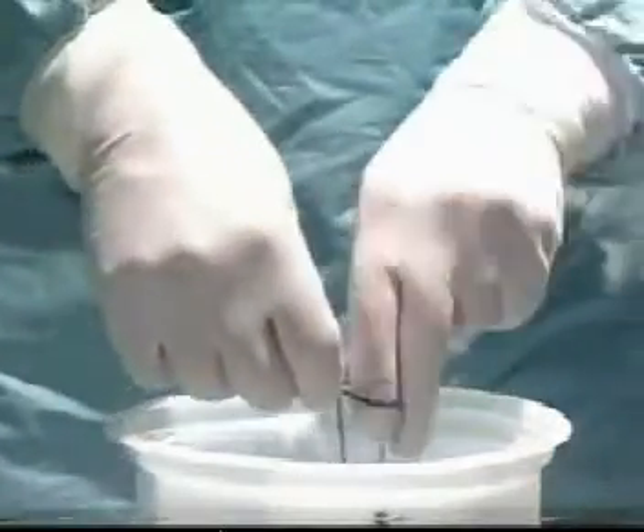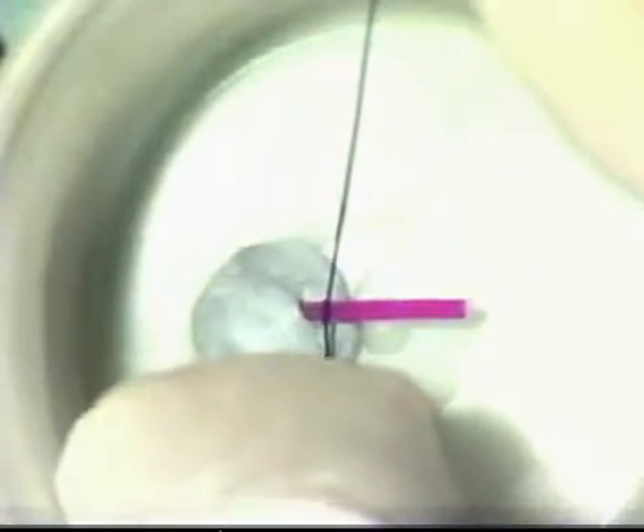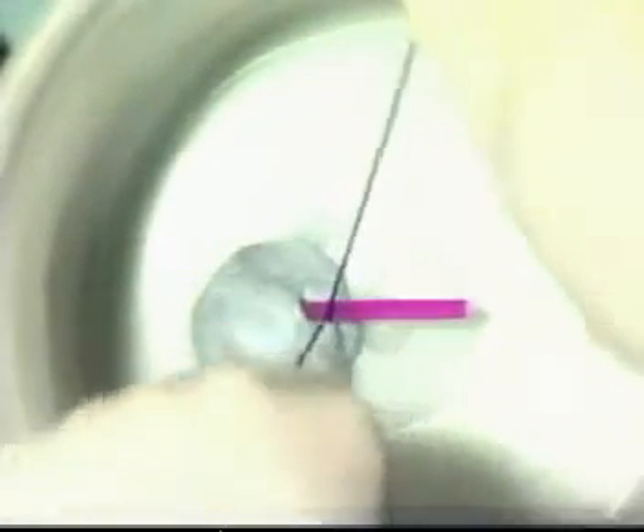Exert no tension on the vessel itself, but tie against counter-pressure from the index finger. Then tie a further throw outside the body, snagging it down with the index finger and tightening it by counter-traction against the finger.